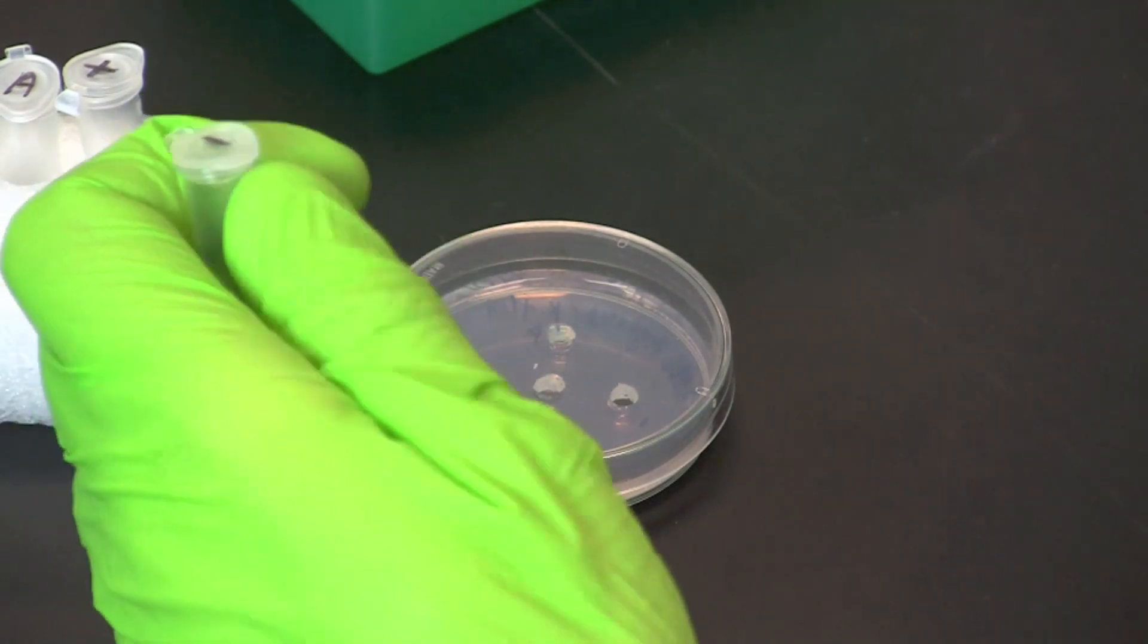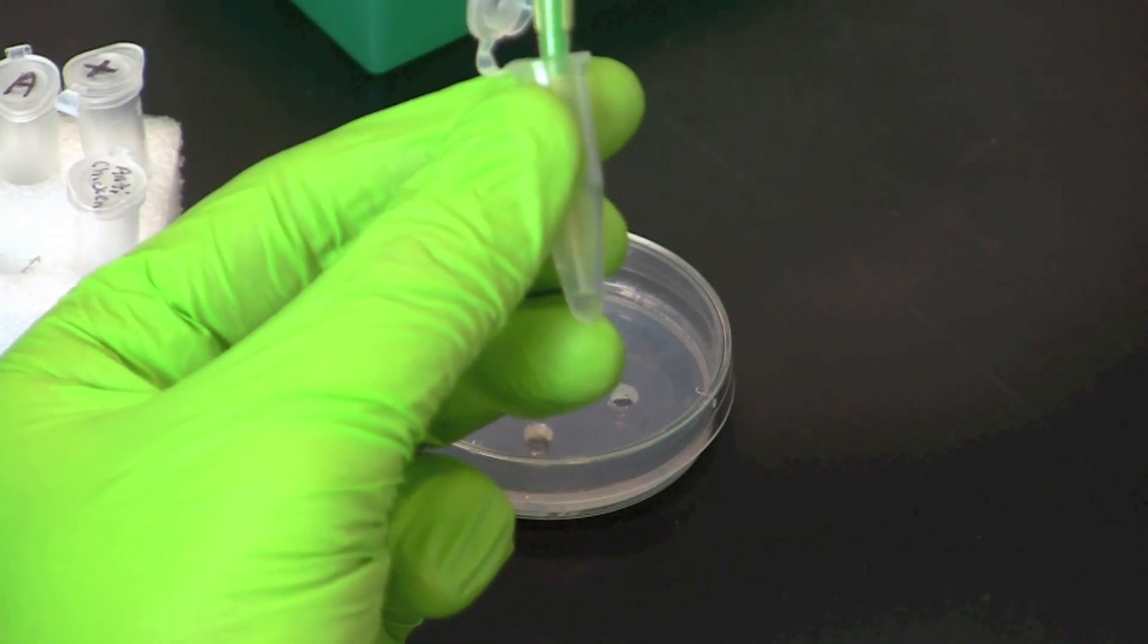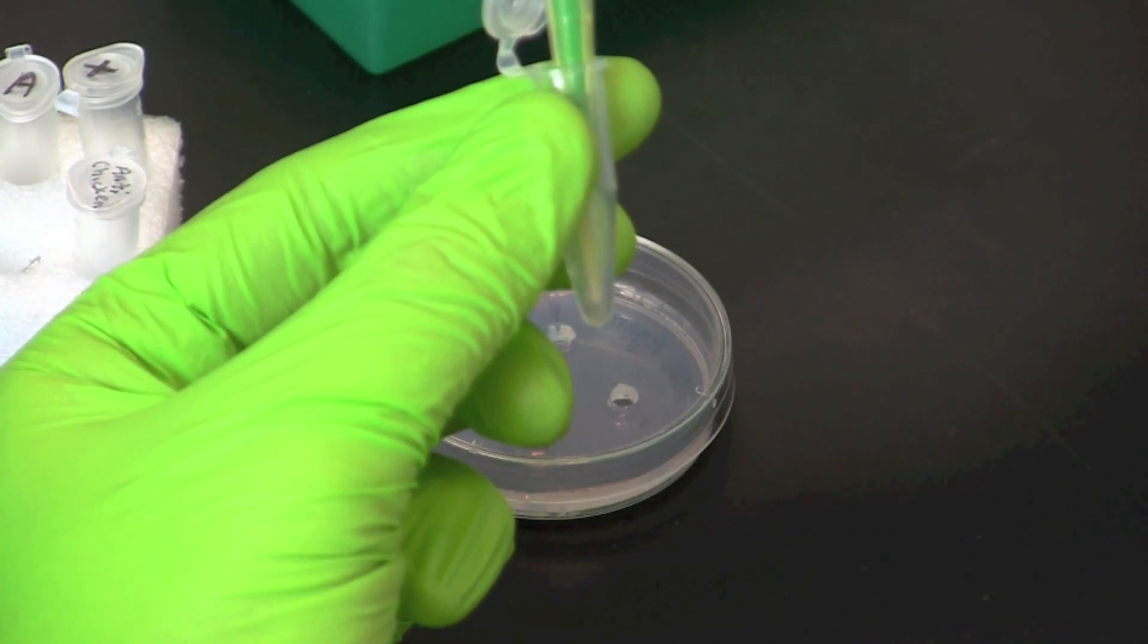Again, using a clean pipette tip, pipette 15 microliters of negative control into the hole labeled minus.